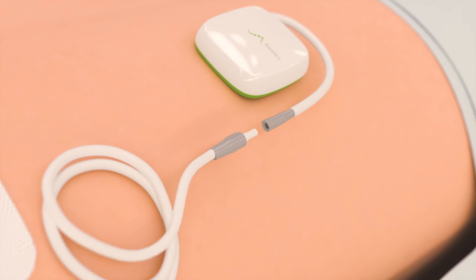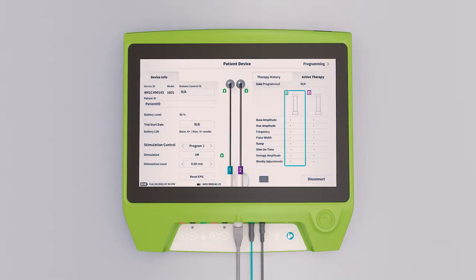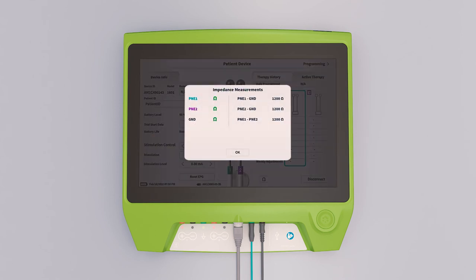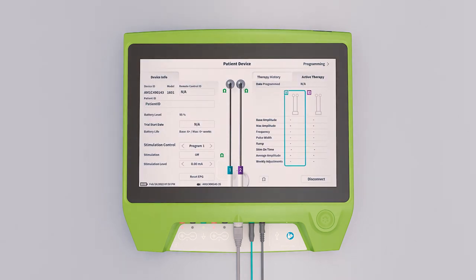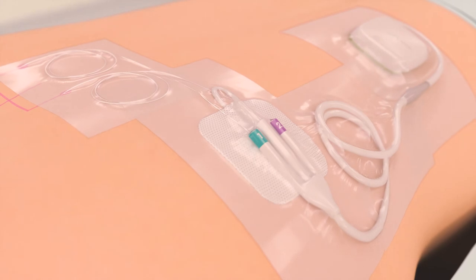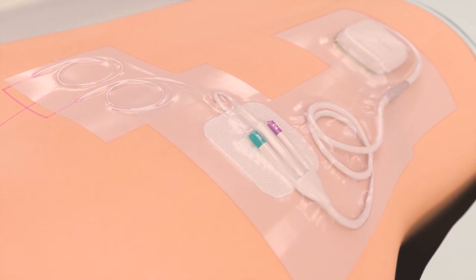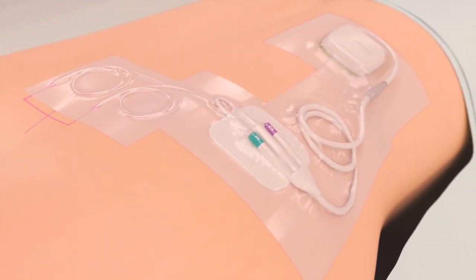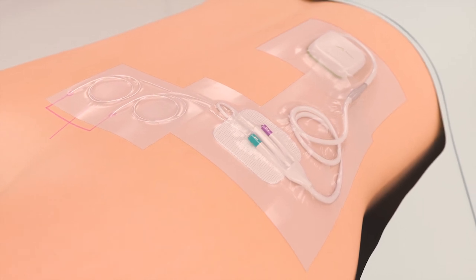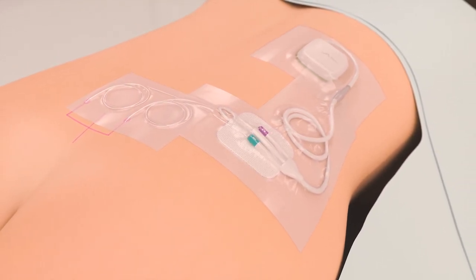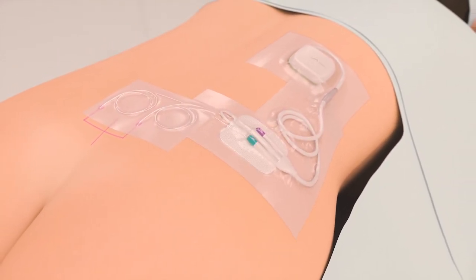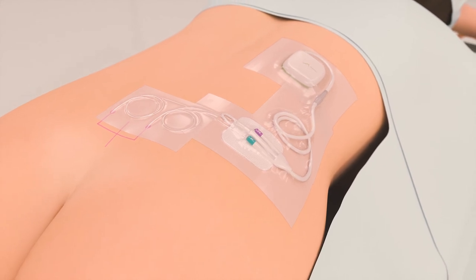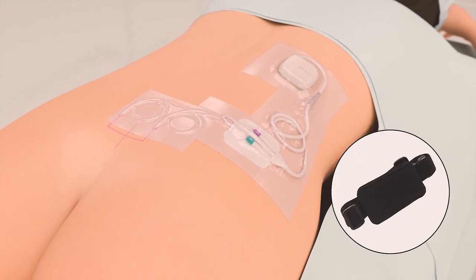The basic trial cable is connected to the trial stimulator. The clinician programmer is then used to wirelessly check lead impedances. Excess basic trial cable should be coiled and taped down, taking care to provide adequate strain relief near all connections. The trial stimulator can be taped securely and comfortably to the patient, or worn around the waist in the provided belt.